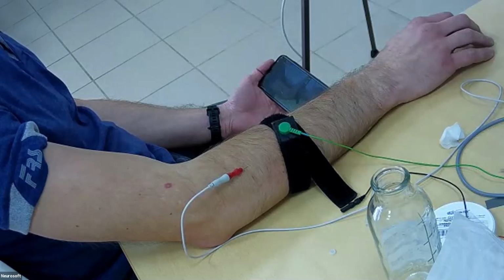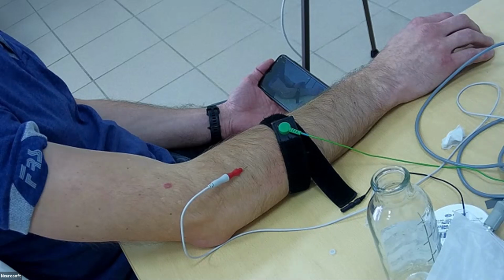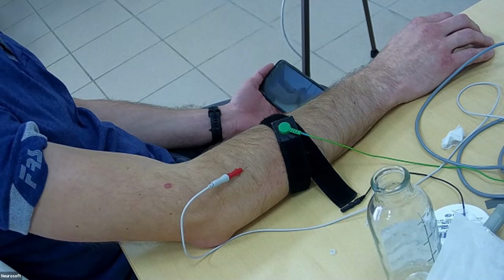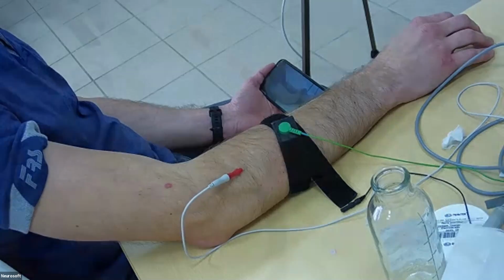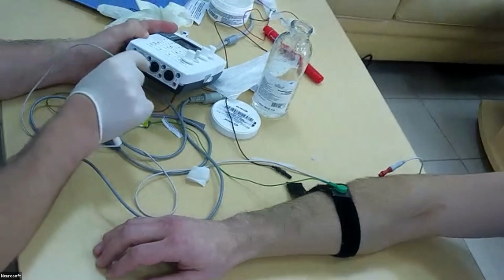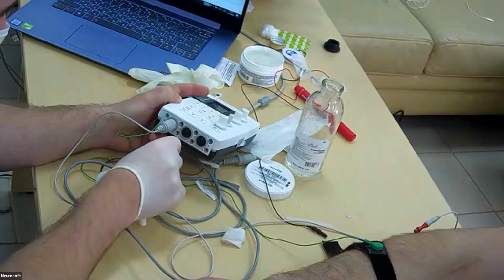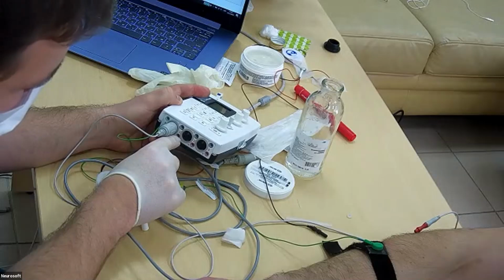So we will set, and we need to use a connector. And combine. So from this DIN electrode we have minus, it's the core of the concentric needle, and it's the cannula.